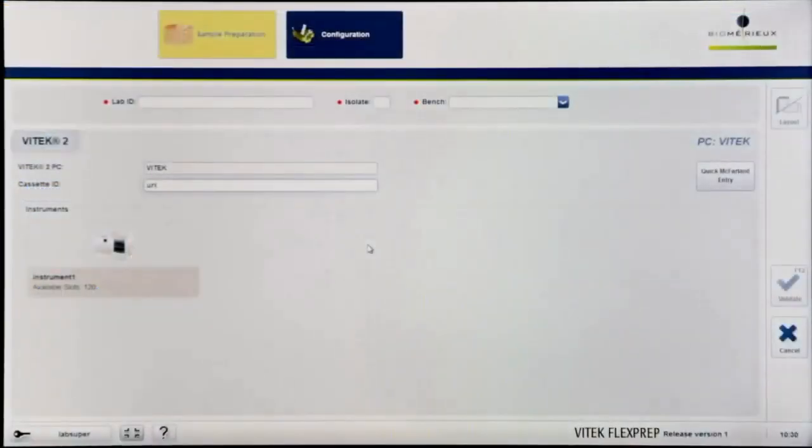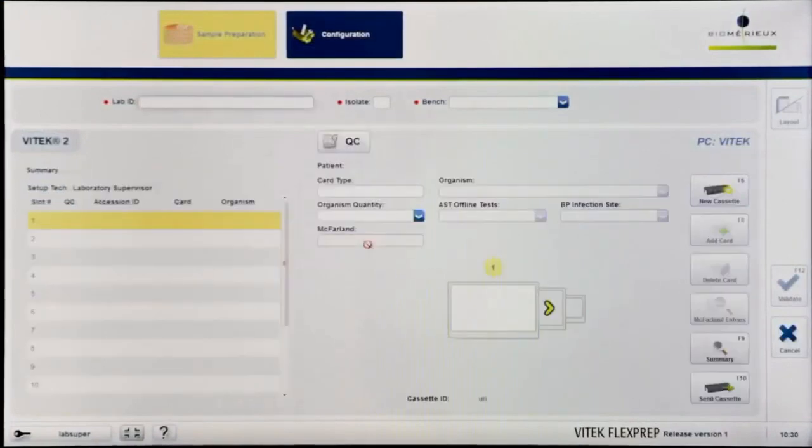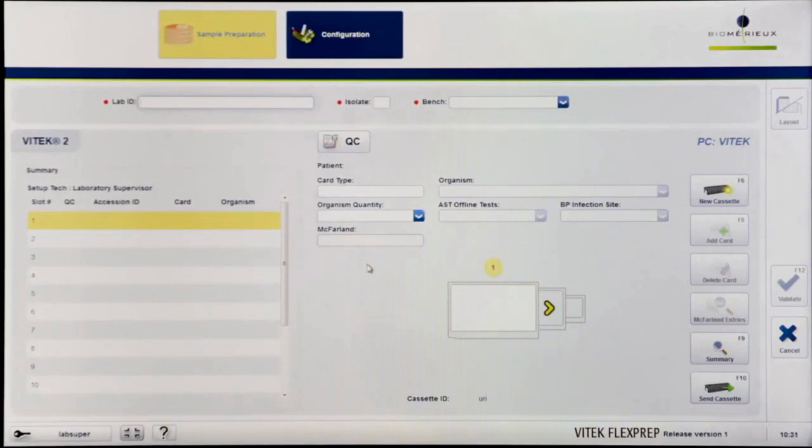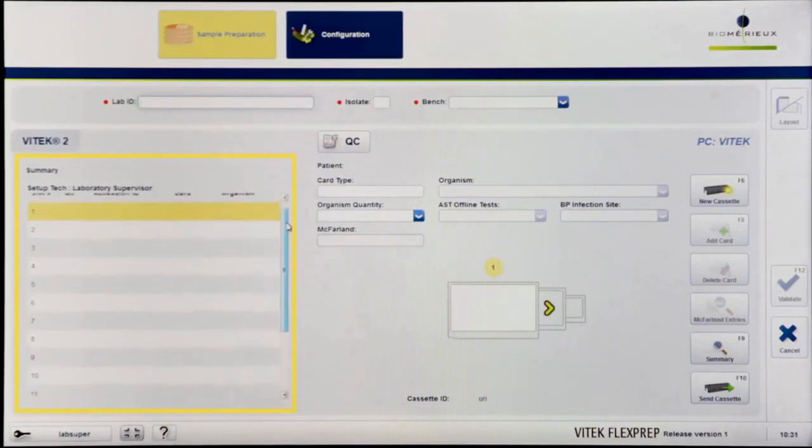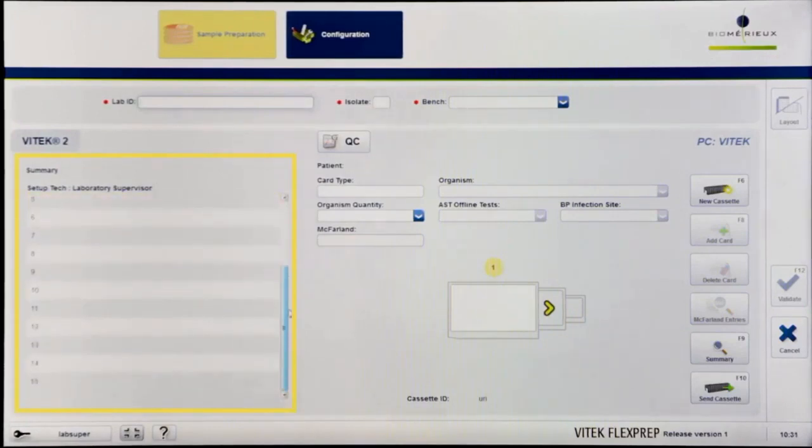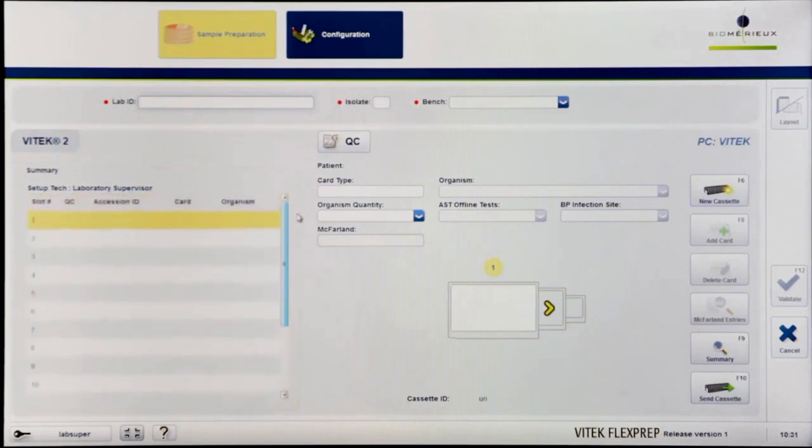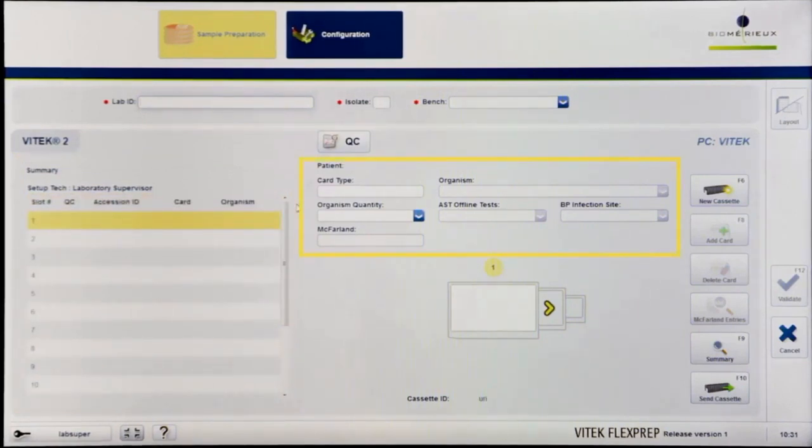Pressing Enter will redirect the user to the Cassette Definition screen of Sample Preparation Mode. The Cassette Definition screen consists of a summary pane depicting the high-level details of the 15 slots in each cassette. Additionally, the screen contains the isolate definition section, where information about an isolate and its associated card is entered.